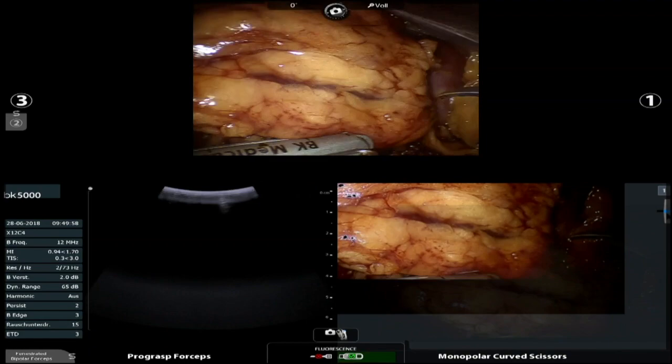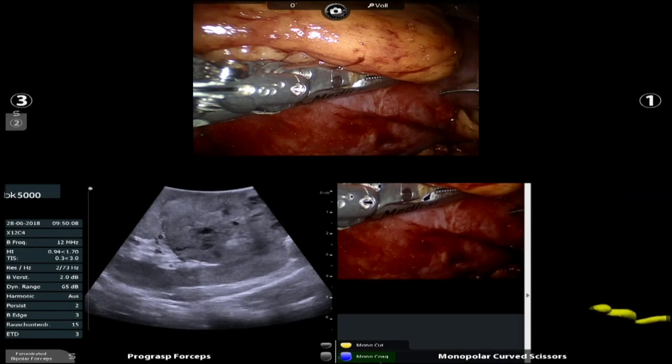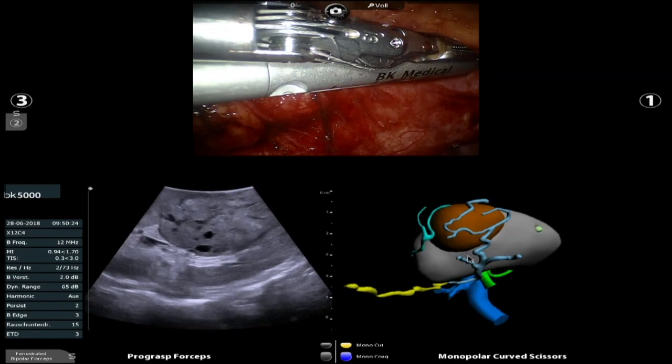Now we're going to mark out our margin of resection. We have a very large tumor. Oh, this ultrasound is beautiful. Somebody has a good quality ultrasound. So definitely in the sinus. On the CT scan, I thought there could be a projection of the tumor deep into the vein, so I'm going to look for that. But I don't see that. The ultrasound's very good. Oh, I love it. This ultrasound is wonderful. A lot of vessels.